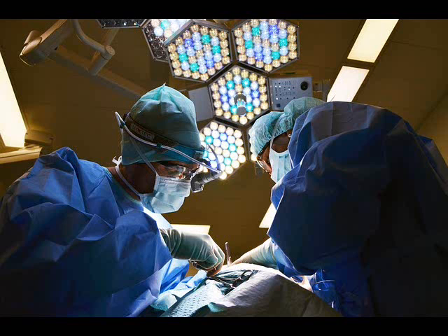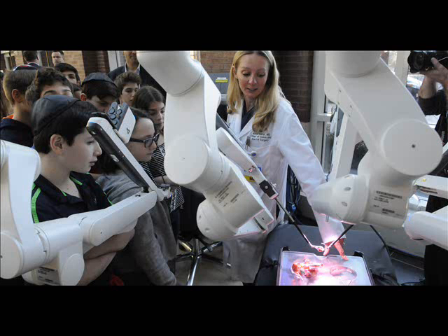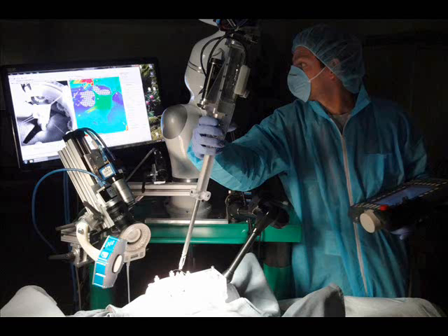Cardiothoracic surgery. Robot-assisted mid-CAB and endoscopic coronary artery bypass operations are being performed with the Da Vinci system. Mitral valve repairs and replacements have been performed. The Ohio State University, Columbus has performed CABG, mitral valve, esophagectomy, lung resection, tumor resections, among other robotic-assisted procedures, and serves as a training site for other surgeons.